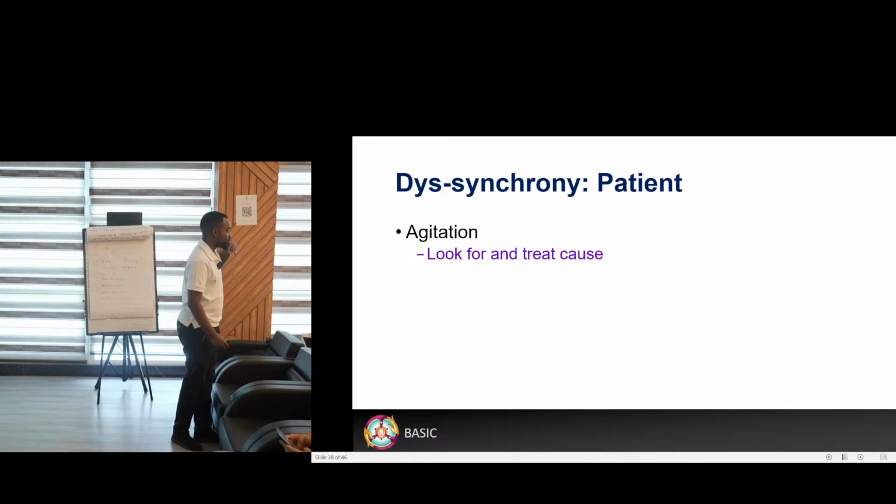You put them on a synchronized mode. Patients can be very comfortable in synchronized mode compared to the control modes when they're under a bit of sedation. But then you have some patients who won't comply with the synchronized mode, and they can be very comfortable in a supportive mode, like pressure support, because they're breathing themselves. So number one could be you have put them on the wrong mode.